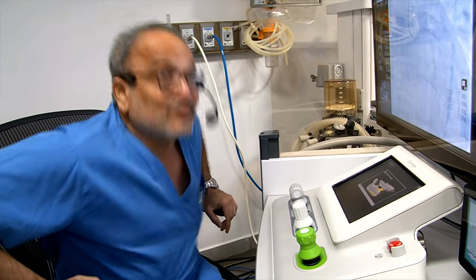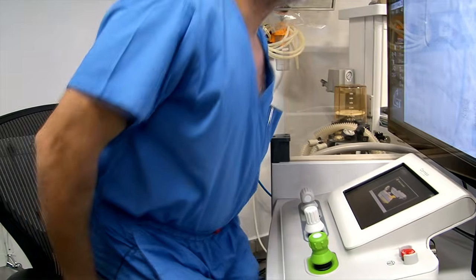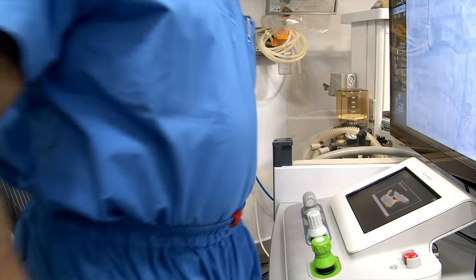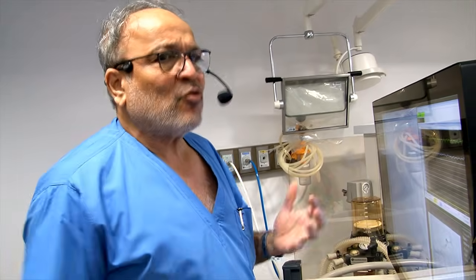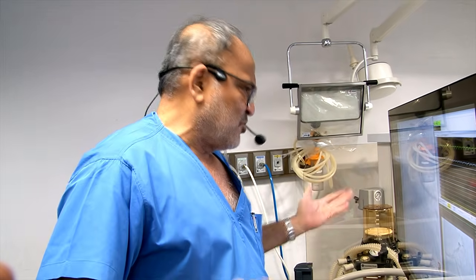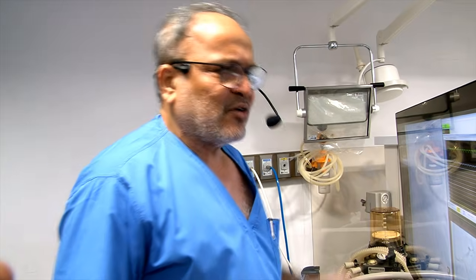No, I agree. This simplicity will make this successful. You have to make the procedure, technique or technology look simple and be simple in practice, then only that technology will have a future. And I am sure this particular technology is going to enjoy a bright future.